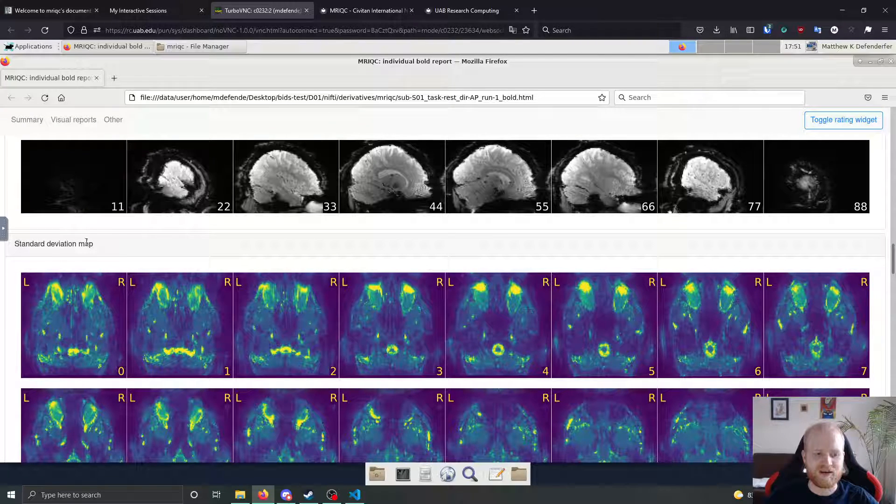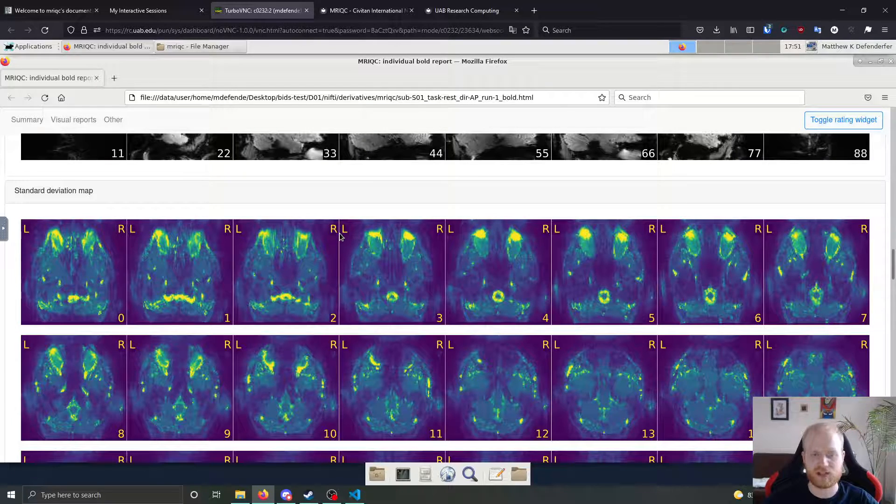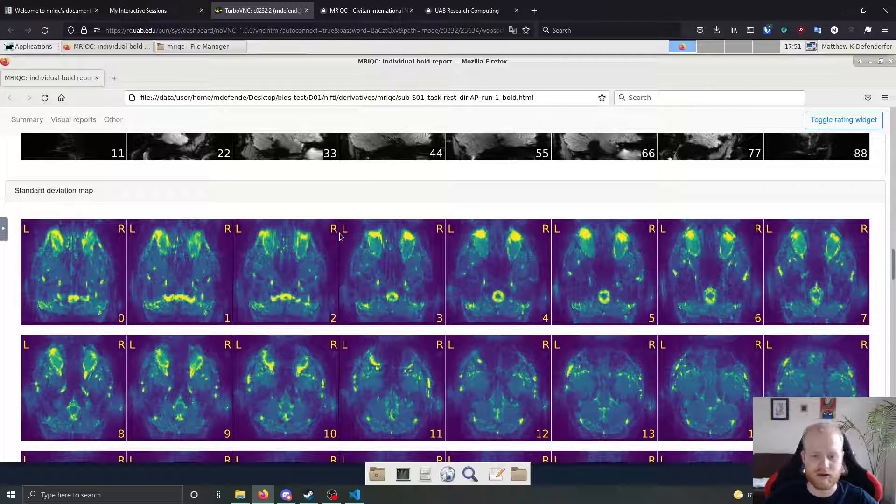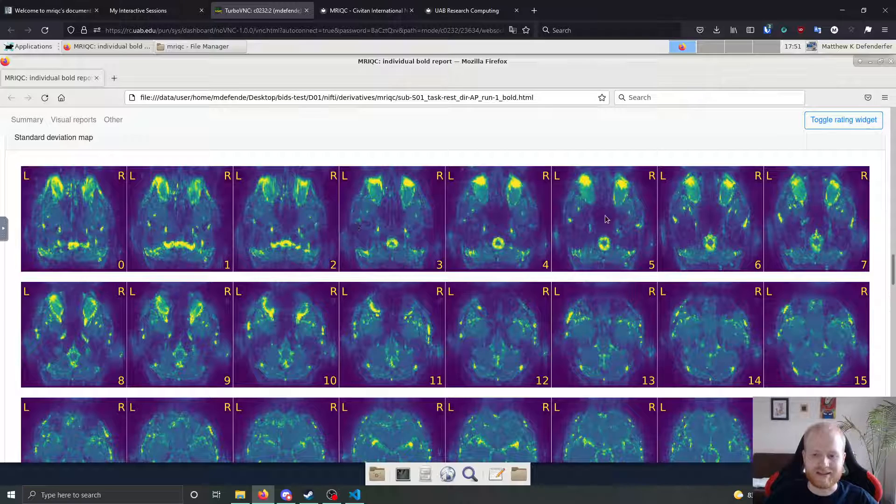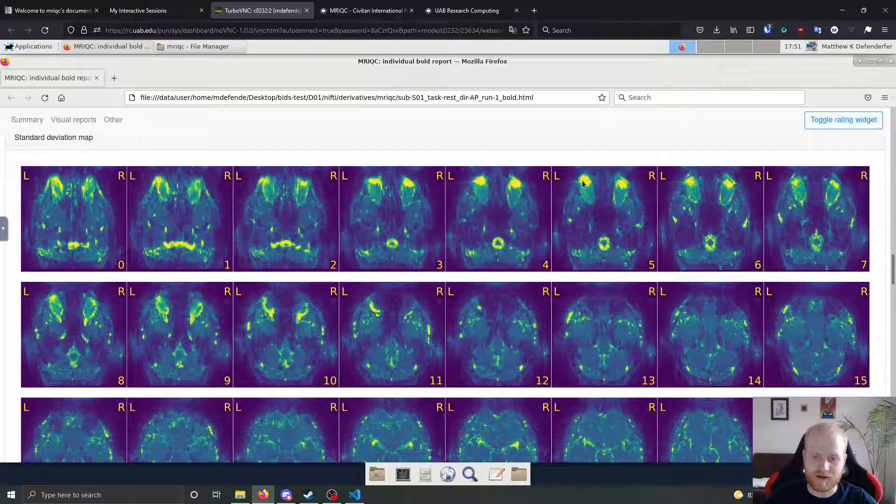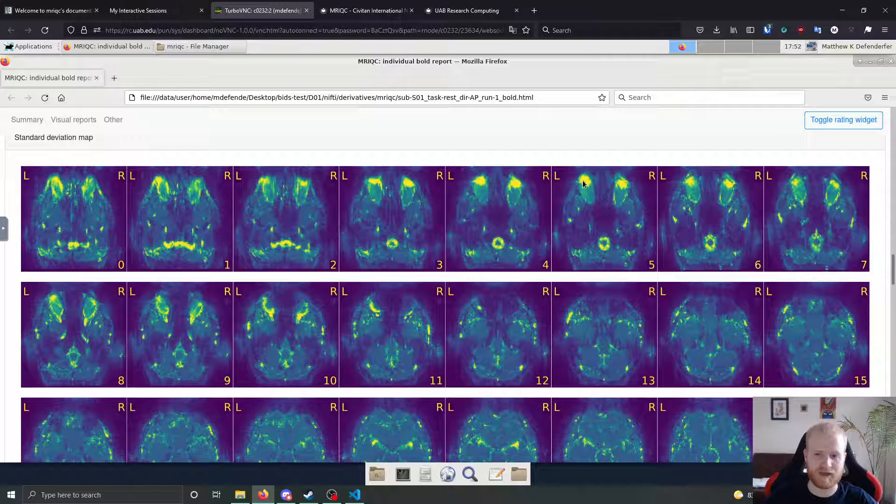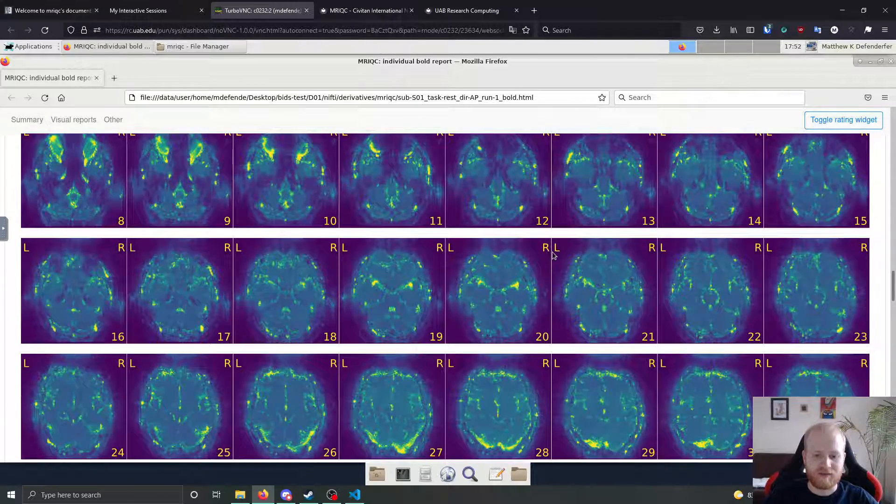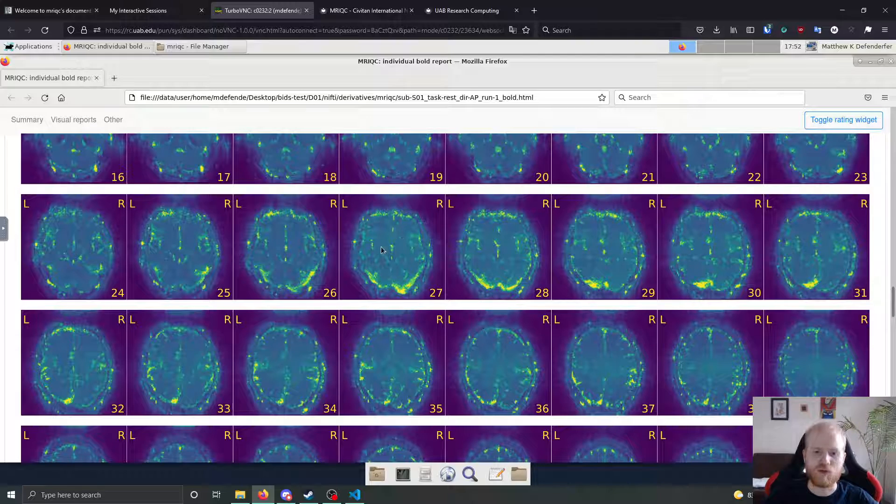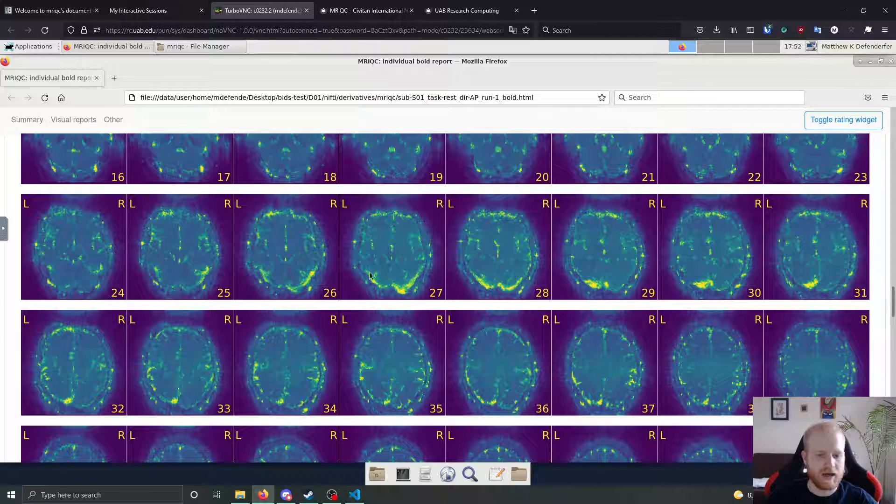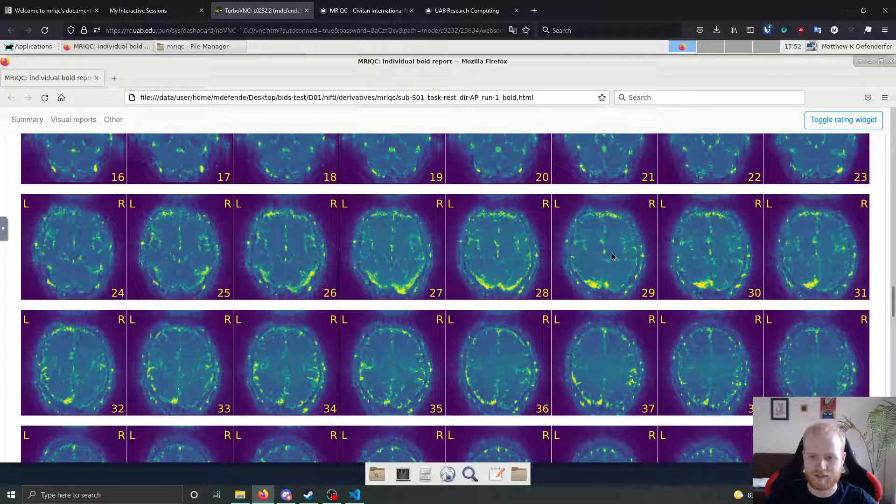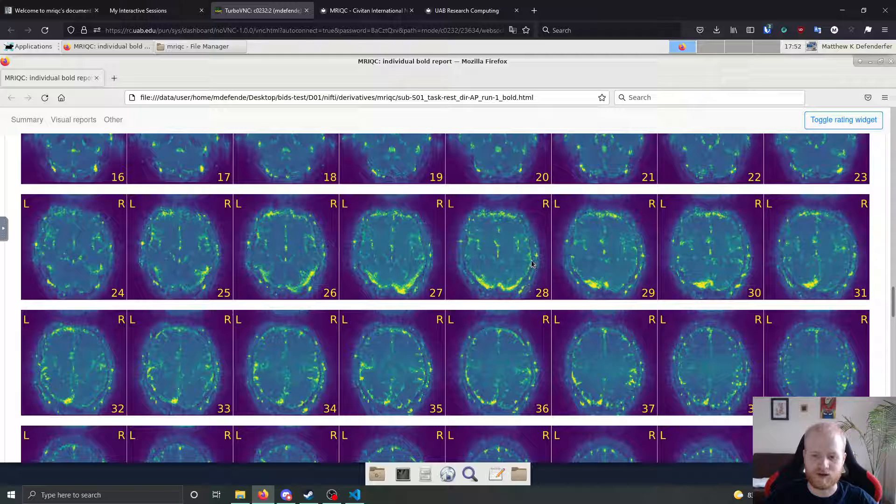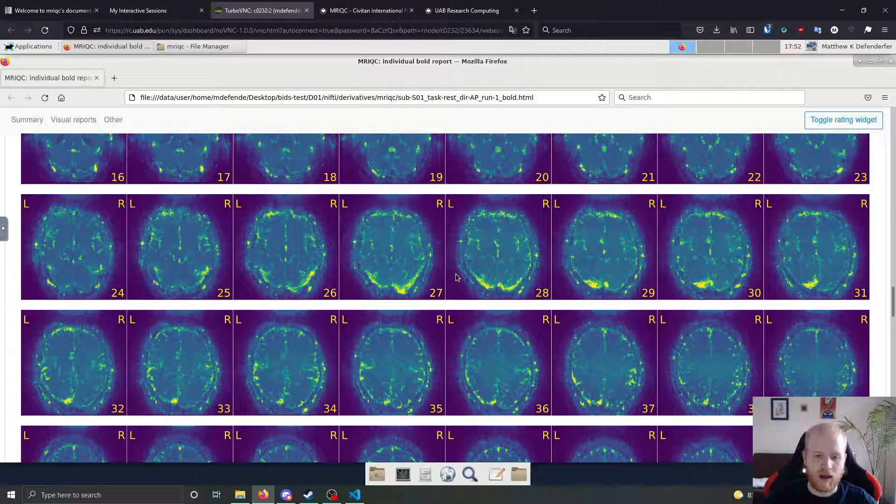As well, it also gives you a standard deviation map. So what is the spread of the values of all of the voxels over the entire time course, you can see that whenever you are looking at the standard deviation of voxels corresponding to the eyes, these have high standard deviation because eyes are pretty constantly moving. So the values in those voxels are going to be are going to have pretty high spread. But whenever you get into the actual brain, what you want are low standard deviation values. You don't want a large spread of values within these voxels. You can see within the scan, the brain itself is pretty low standard deviation.